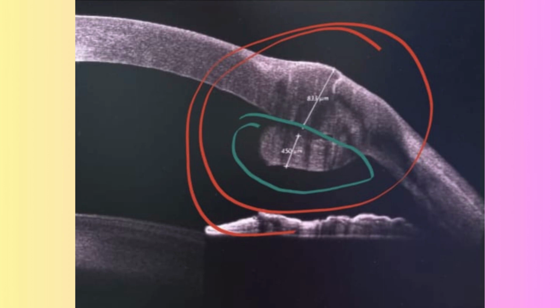There are no anterior synechiae. Angle looks fine, but the junction posteriorly is not smooth. This is a possible complication. It can happen, especially in PKPs. So what could be the different scenarios, how can it develop? Today we will study this.